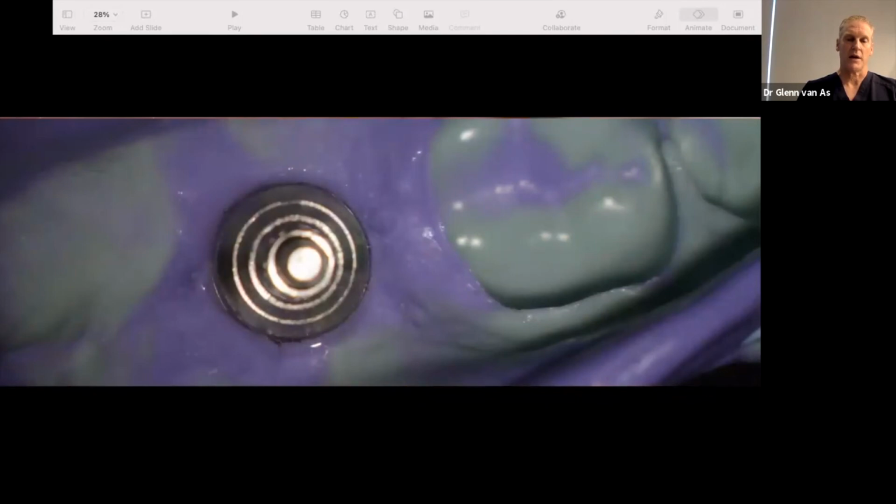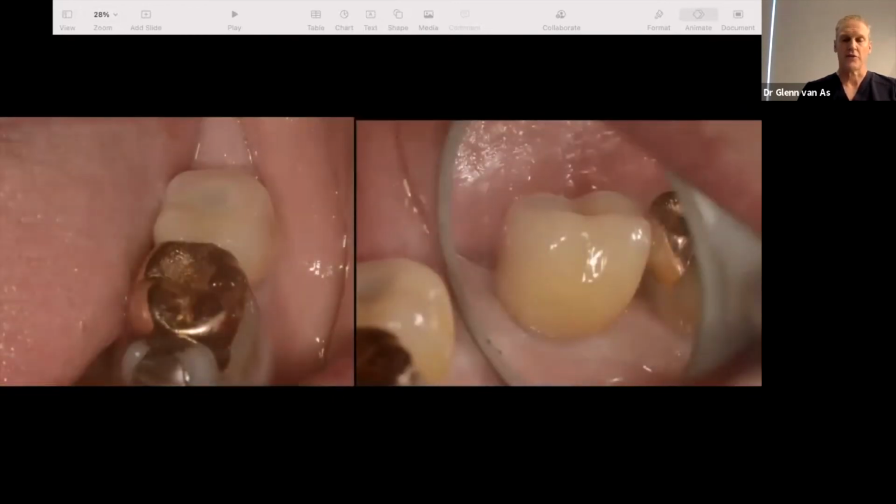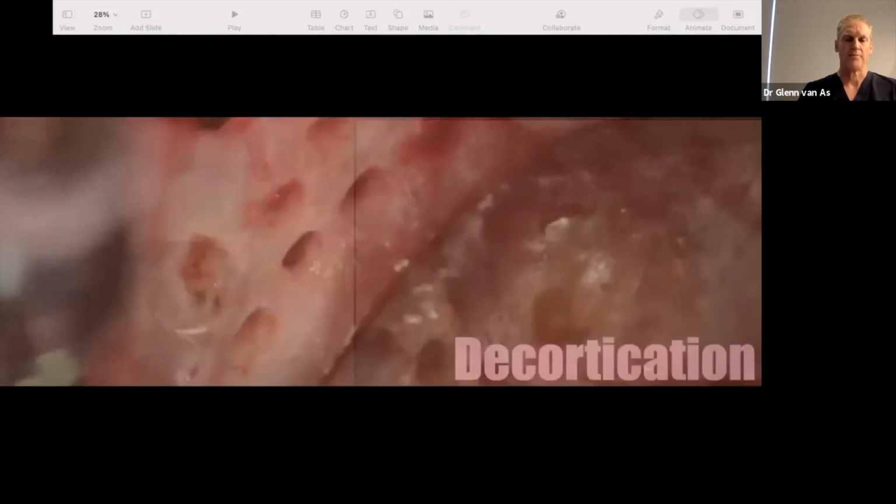And again, I'm not going to tell you that it's a perfect placement because it was a little far distal. And now this is resolved with all the guided surgeries, where we can precisely place these in situations with big ridges like this in a very easy and quick fashion through guided surgery. There's a final result and the nice appearance on a case where we had staged. So again, lasers can be used prior to implant placement where you want to stage it.